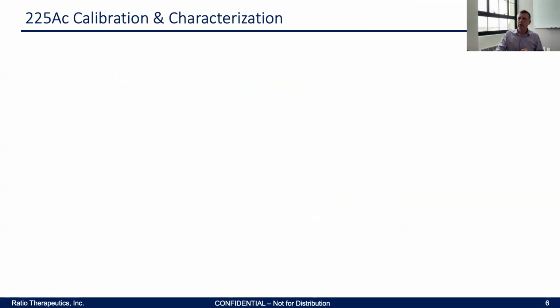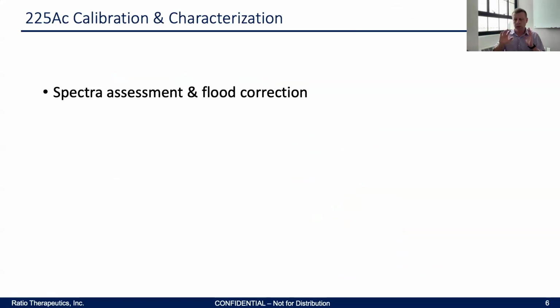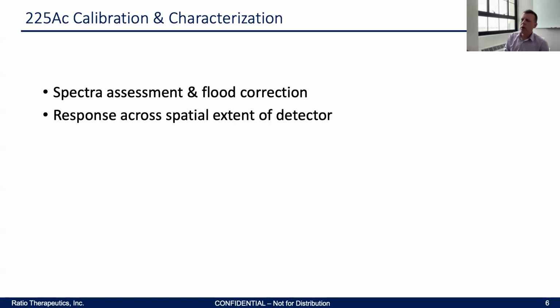Okay, so for this section of the talk, we have just a few things that we'll highlight briefly. We're going to touch on an assessment of the spectra, which can be noisy with actinium, and then some of the flood corrections that were done once those settings were put in place. Just look briefly at, after that flood correction, how is the response of the detector across its spatial extent?